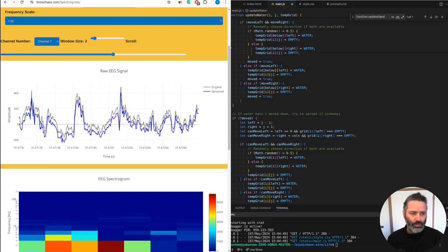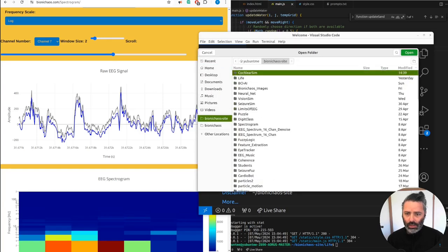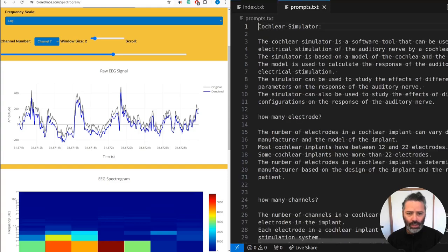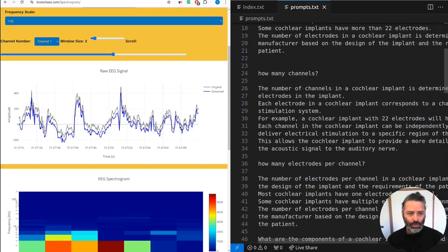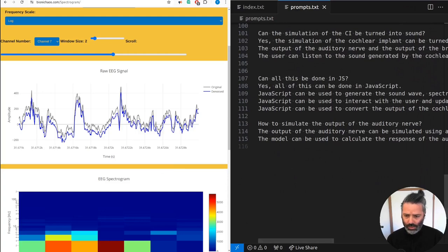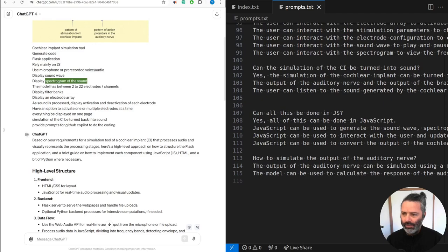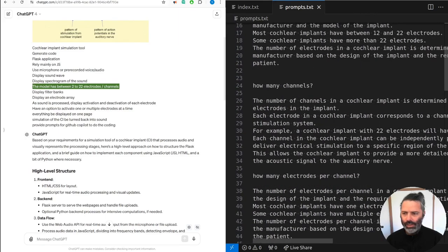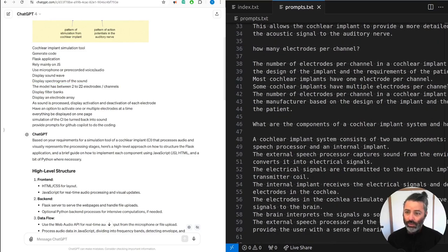Let's open another Visual Studio Code window. Open folder. This should be called Cochlear Sim or Simulator. Currently have only two files. That one is an interesting thing. It's just another way of interacting with GPT. And we have a spectrogram of the sound. For example, over here we were essentially having the same thing as for the prompt, but you can interact with it on the fly, which is just really good.